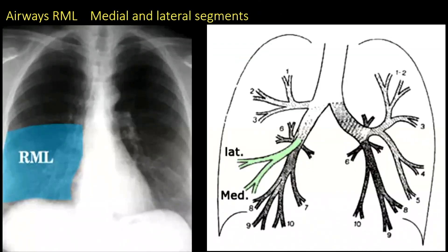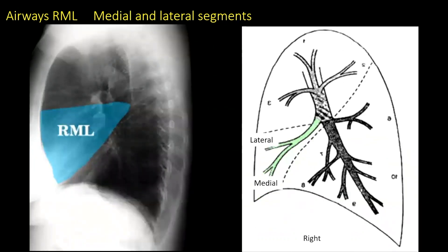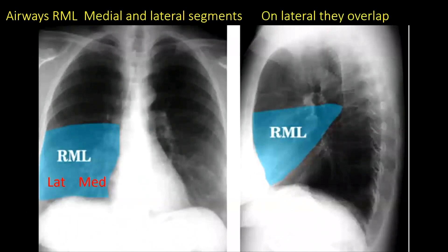The right middle lobe is familiar to all of us, with the smooth upper border representing the minor fissure, and it has a lateral and medial segment. On the lateral film, the minor fissure is at the top of the right middle lobe and the major fissure is posteriorly. The lateral and medial segments overlap each other on the lateral film, but on the PA you can clearly differentiate the lateral and medial segments.